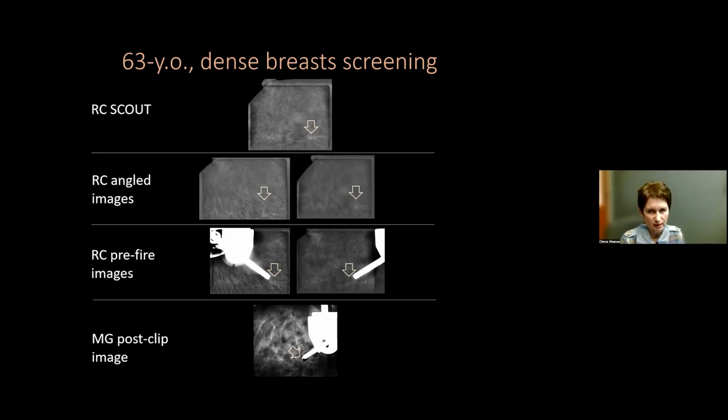So having a CEM-guided biopsy eliminates those extra steps and helps tremendously. So if at all possible, please try to acquire a CEM-guided biopsy device, which is really just a modified upright stereo unit. And the technique of a CEM-guided biopsy is very similar to your stereotactic, but you can use a DBT guidance with that process also.